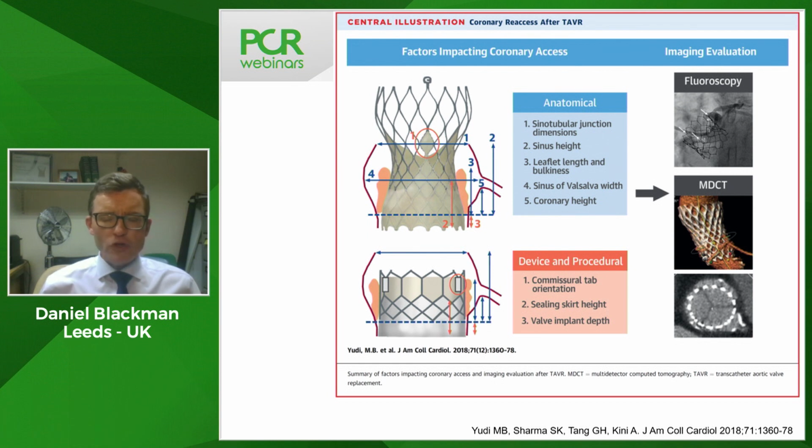It may be, if you're treating the patient with a valve that more readily facilitates reaccess, you may feel more relaxed about doing it afterwards. And that will give you the option to see if the patient's symptoms resolve. And then occasionally you have patients where, particularly in emergency situations, you feel that the only way to treat the patient is to do everything at once.